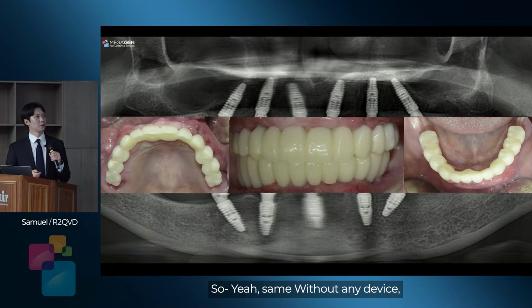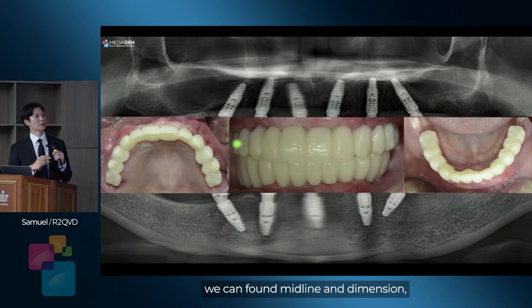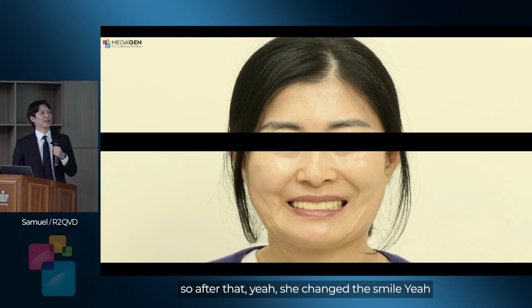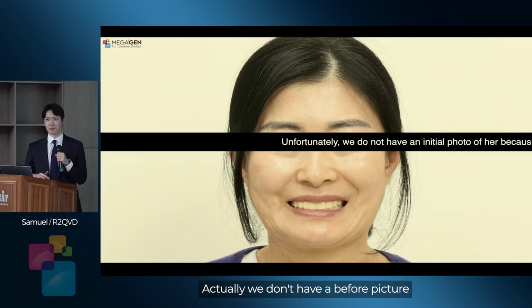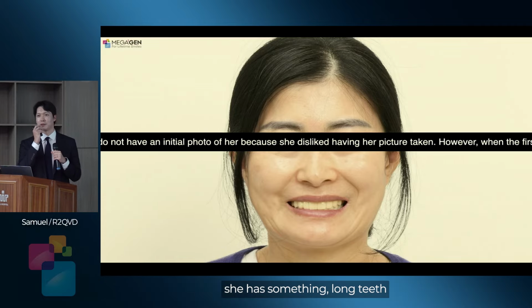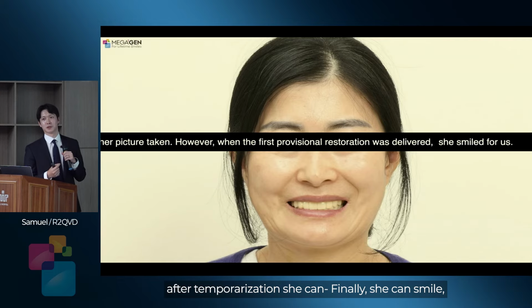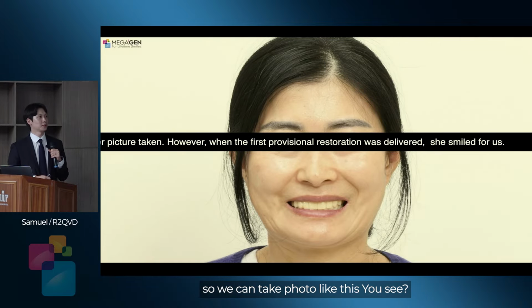So, same, without any device, without any X-ray, we can find the midline and dimension, height of VD, and everything we can do like this. After that, she changed her smile. Actually we don't have a before picture because she didn't want to take a picture with her teeth. Something was wrong with her teeth. But after temporization, she can smile. So we can take a photo like this.